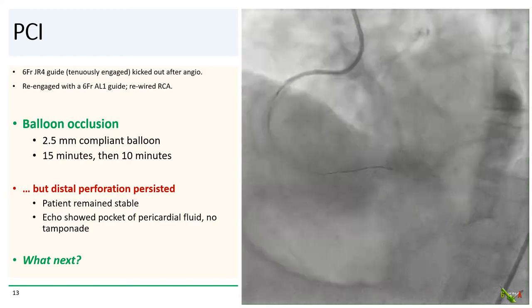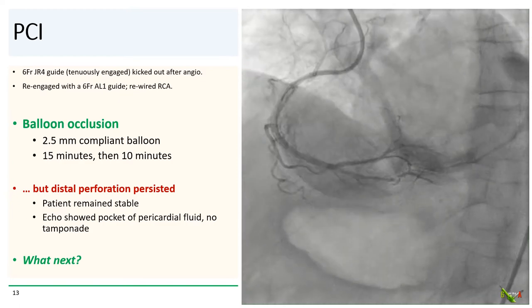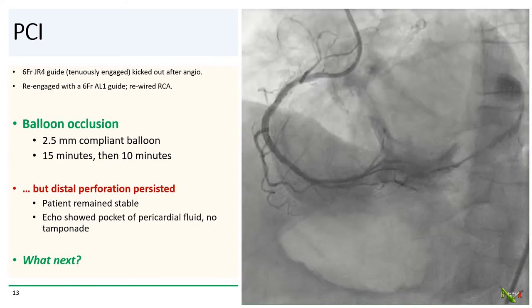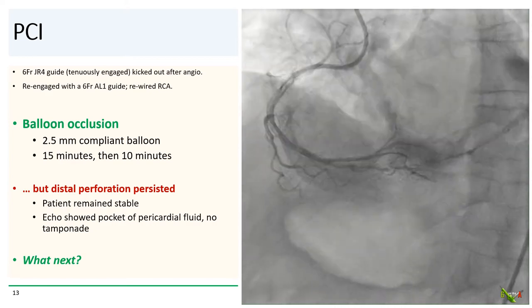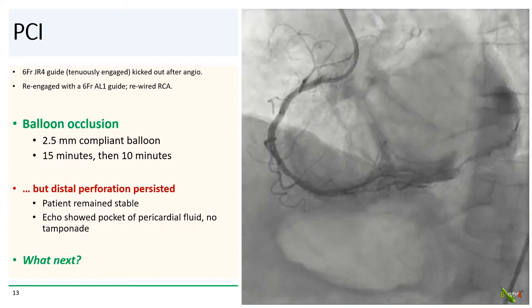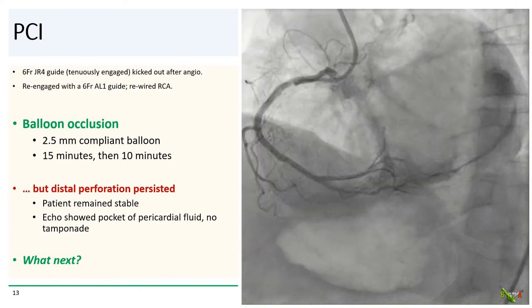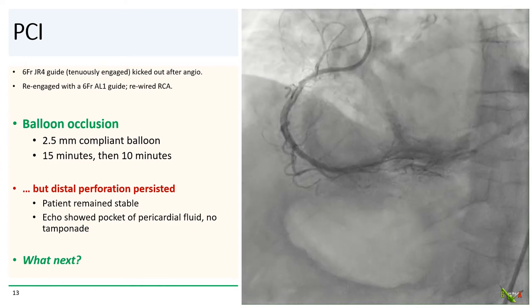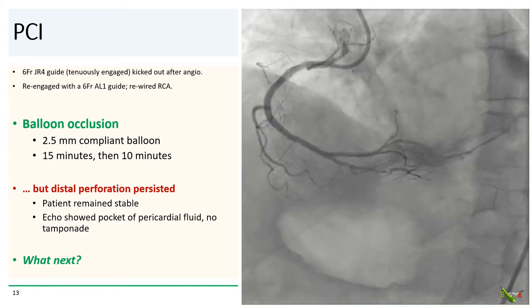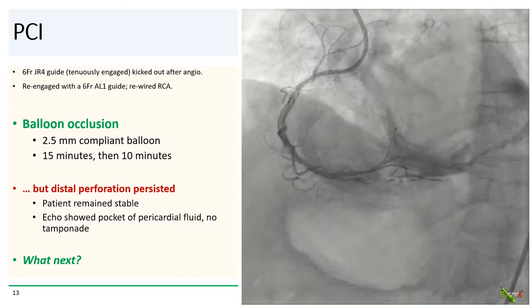Back to our patient. After the final shot, our JR4 guide kicked out, so we decided to reengage with an AL guide and rewire the RCA. We passed a 2.5 mm compliant balloon into the RPLB and inflated it for 15 minutes and then 10 minutes. But as you can see from this angiogram shot after the balloon occlusion, the distal perforation persisted — the posterolateral branch did not close off.